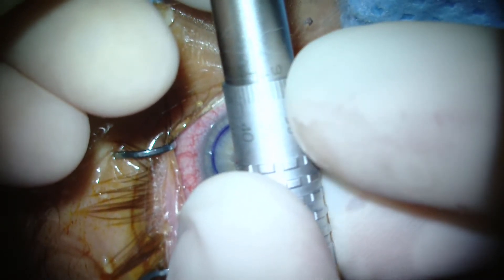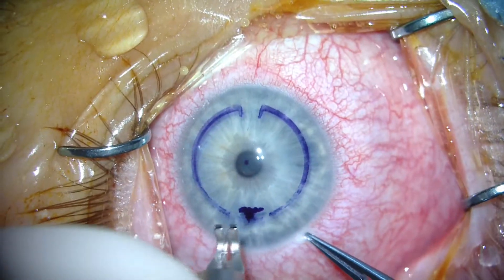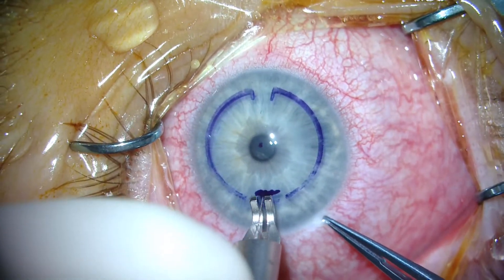We then make a single RK incision using a guarded diamond blade that we set to 80% depth of the corneal thickness we measured in the operating room just before the start of the surgery.